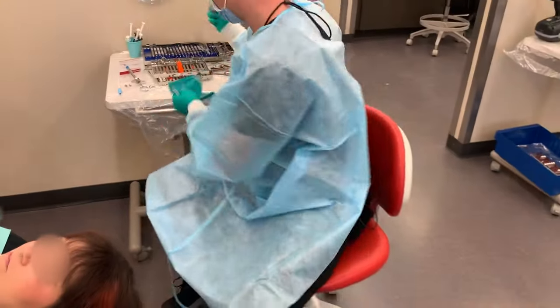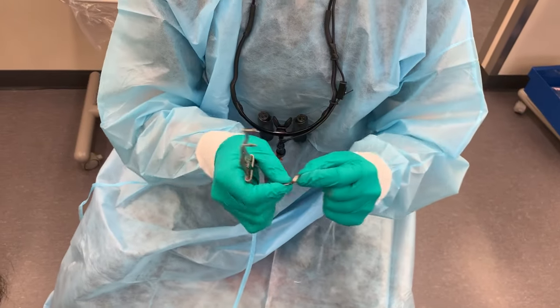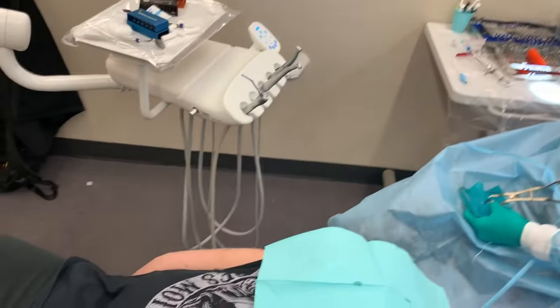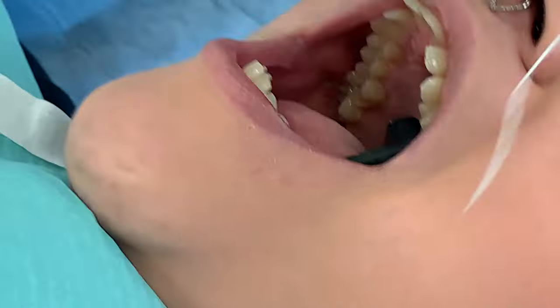Next thing: I have a clamp that I already tried on the patient to make sure that it fits. I'm going to put this prop in your mouth, and then I just place it all at once.